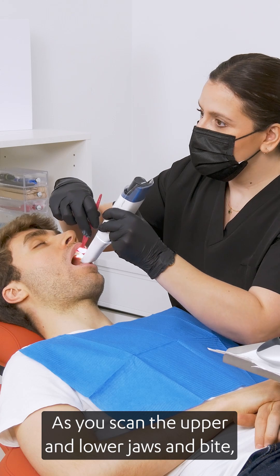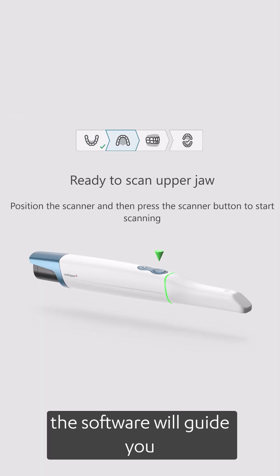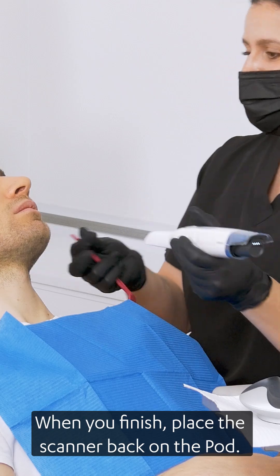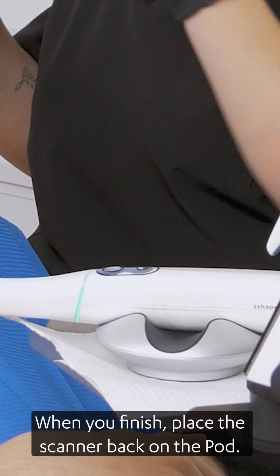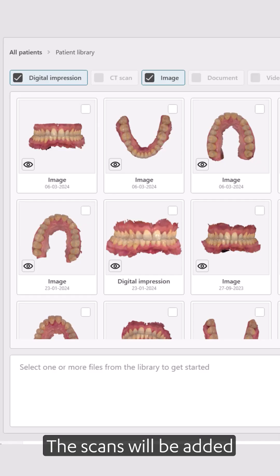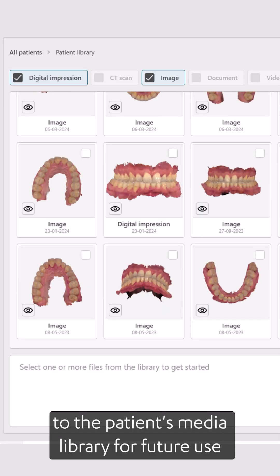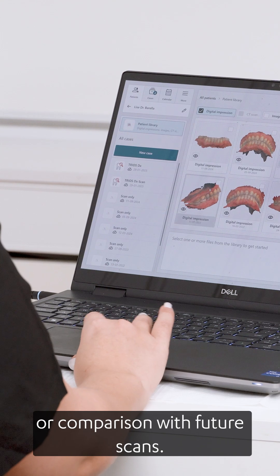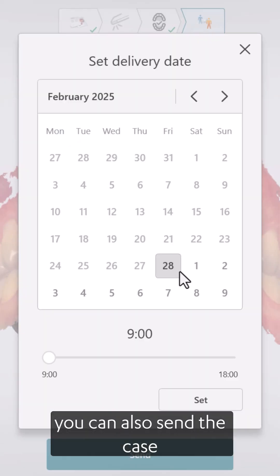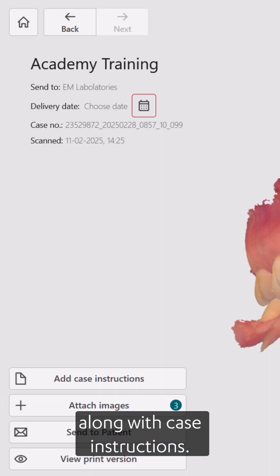As you scan the upper and lower jaws and bite, the software will guide you through your desired workflow. When you finish, place the scanner back in the pod. You can now review the scans and engage with the patient. The scans will be added to the patient's media library for future use or comparison with future scans. You can also send the case to the lab or partners along with case instructions.